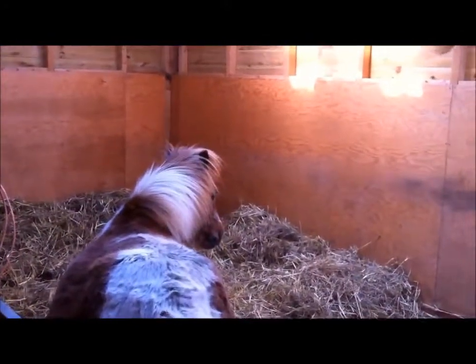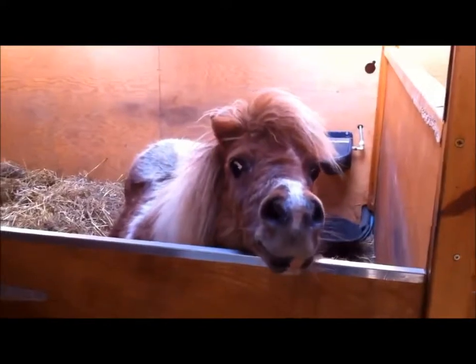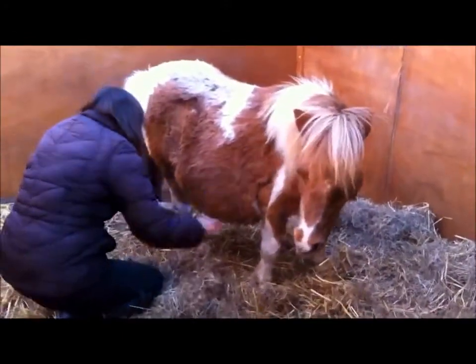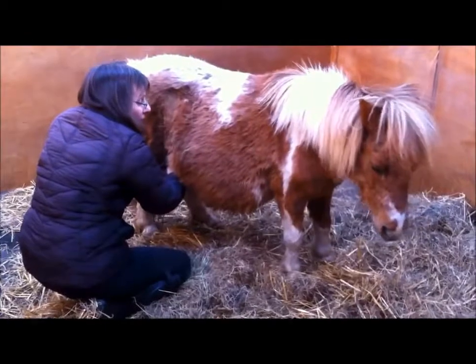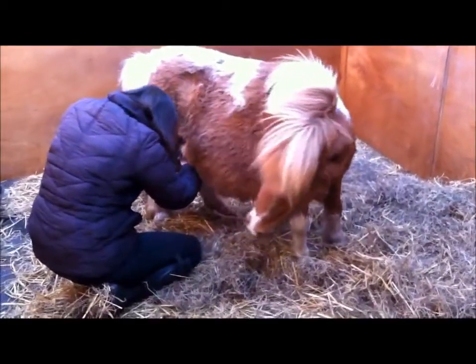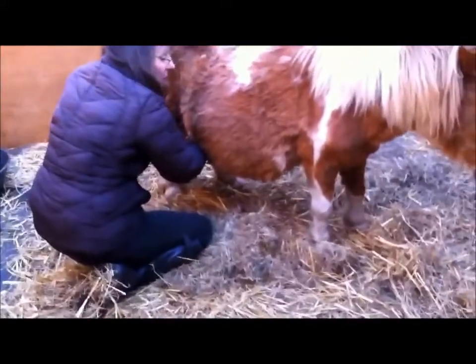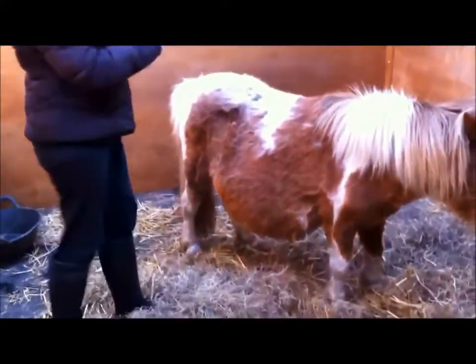So we'll take our collection pot and go find Rosie. This is Rosie — we're just going to get the sample. Good girl. I don't tie Rosie up because she's used to it. We've got half a mil in here and we're going to test it now.